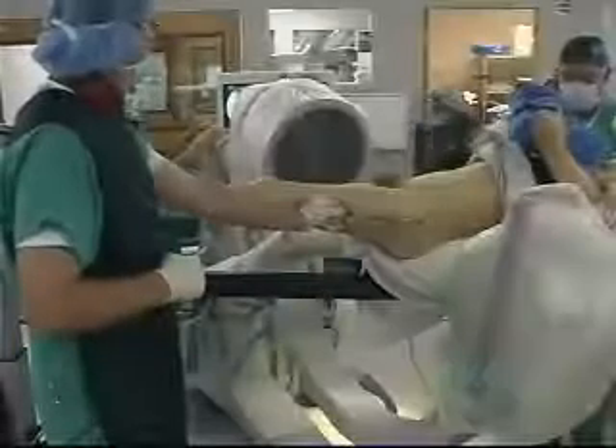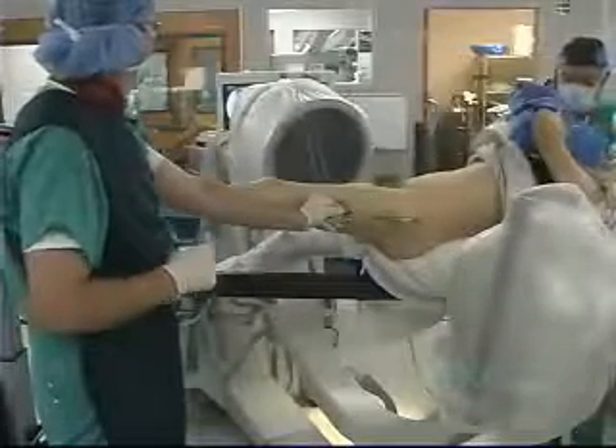The reduced fracture is seen on these AP and lateral views. Now we need to determine the alignment of the neck before we start, so that we will know later on where we want to direct our guide wire.